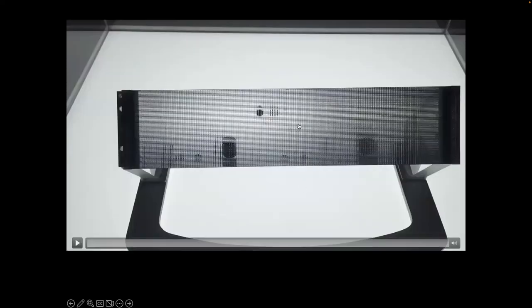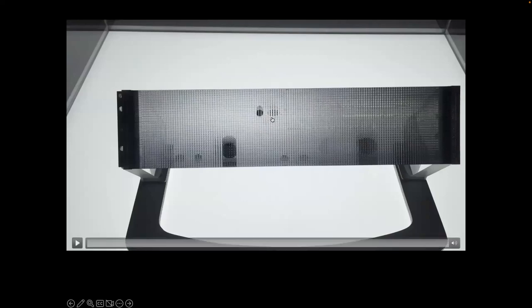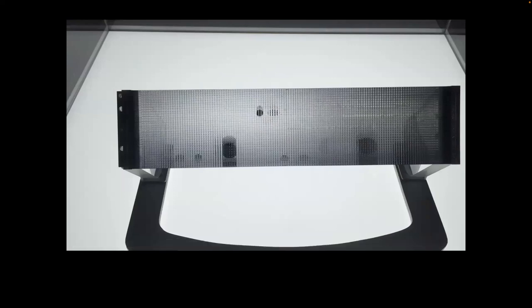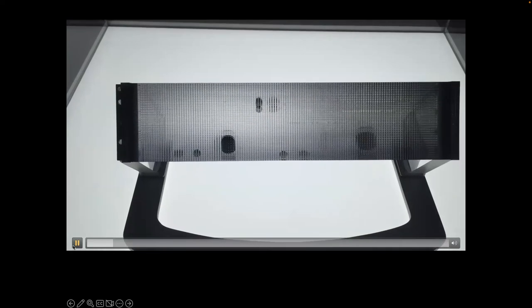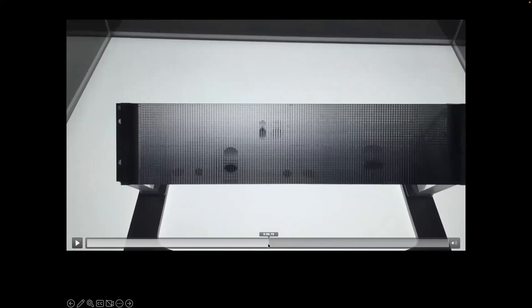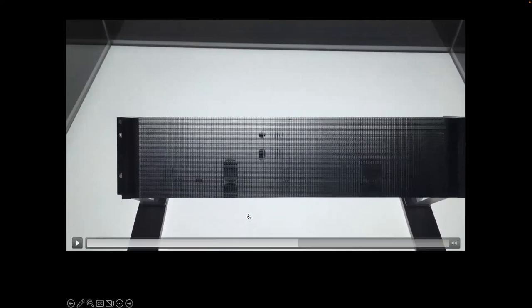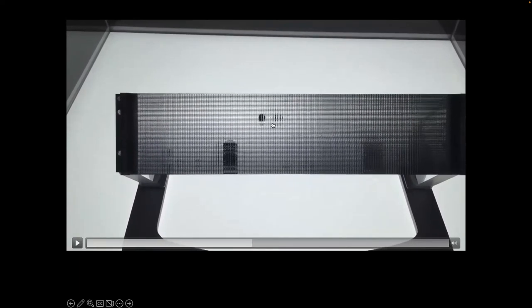The anti-scatter grid is demonstrated using a display case at GE in Milwaukee. Placing objects behind the grid shows that unless a photon travels at exactly the correct angle, it is absorbed. The grid works in both the fan and z directions, allowing only primary x-rays through while blocking scatter.